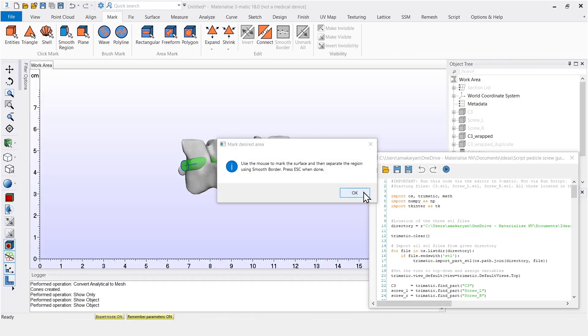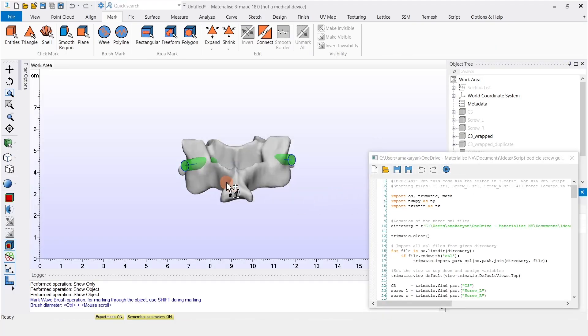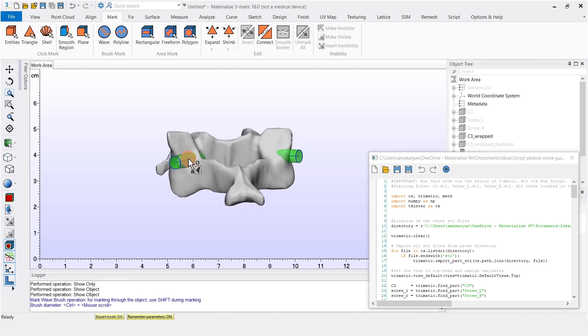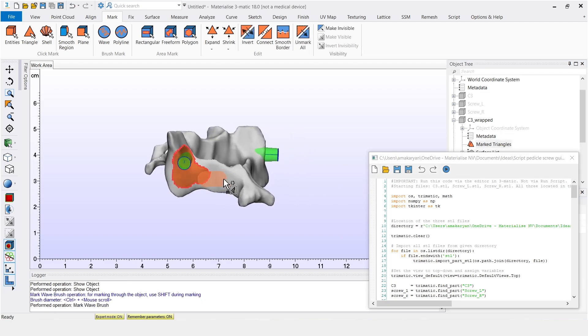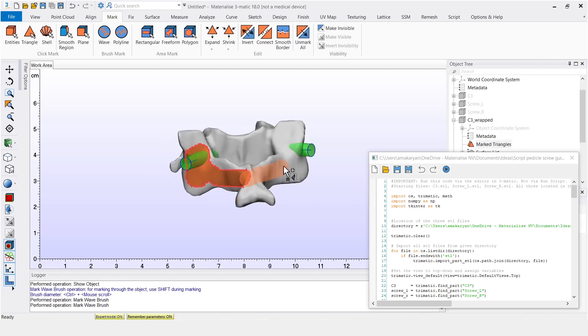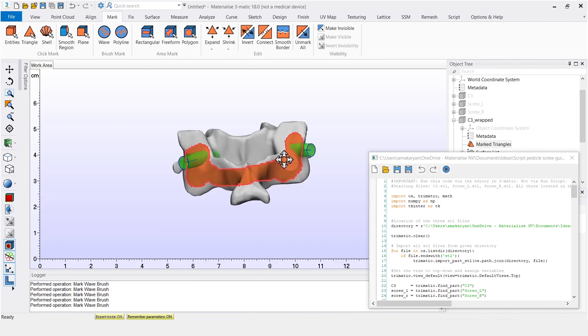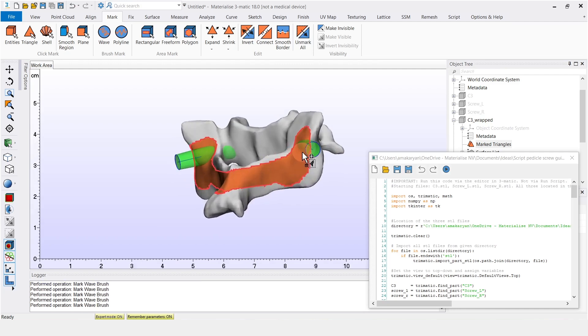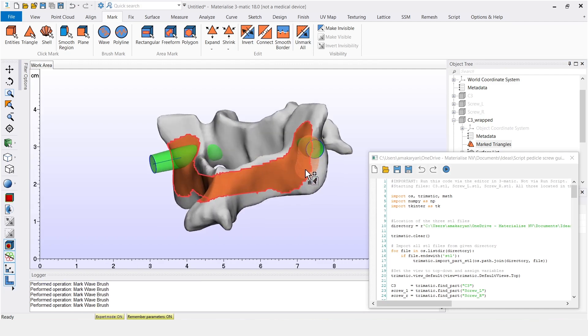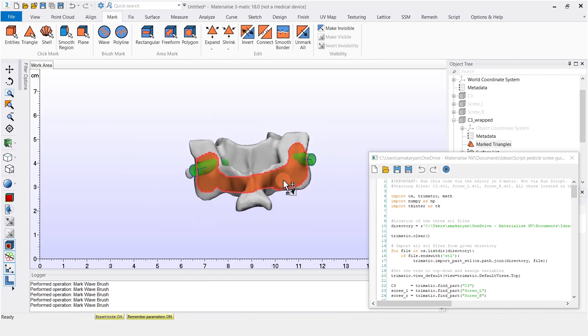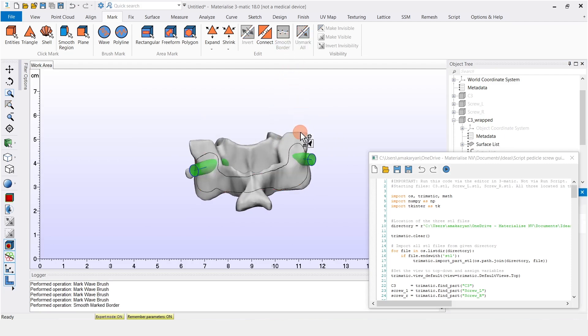And the script requires input for the next step. So I indicate the surface that will act as a base for the surgical guide. And after marking and smoothing the border, press escape.